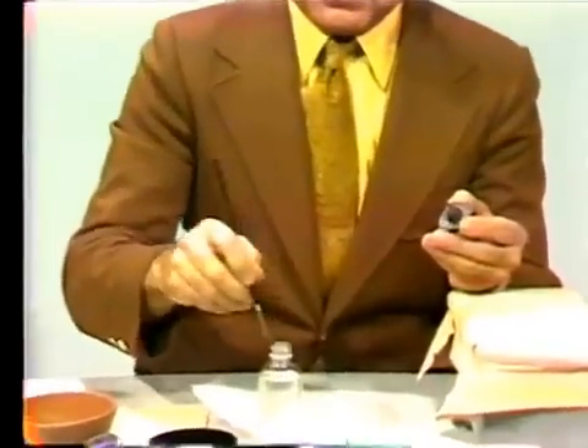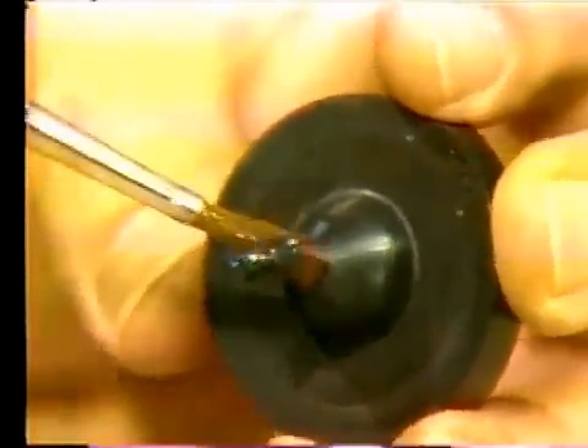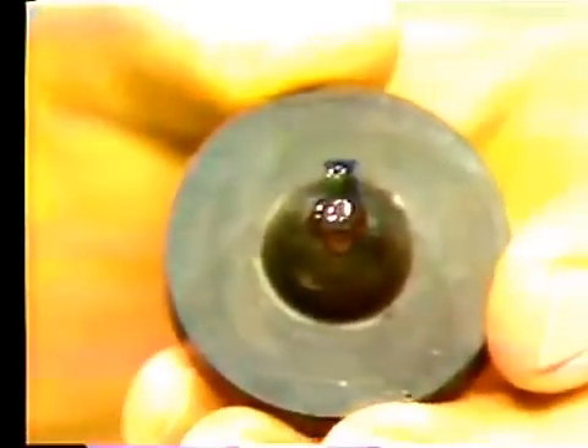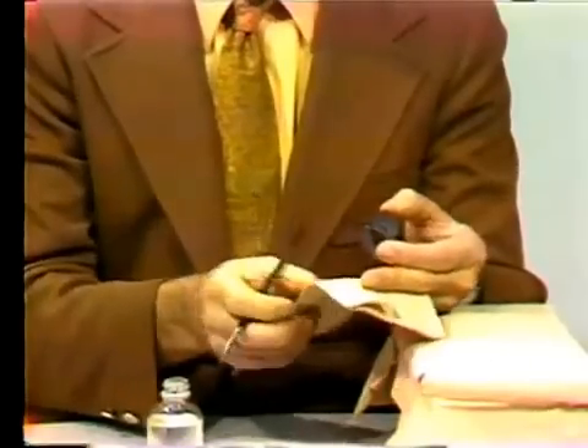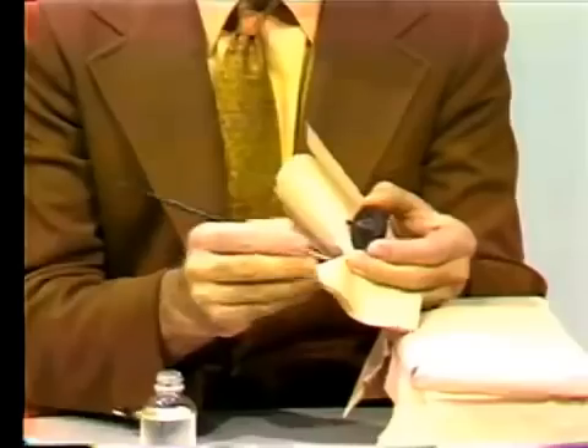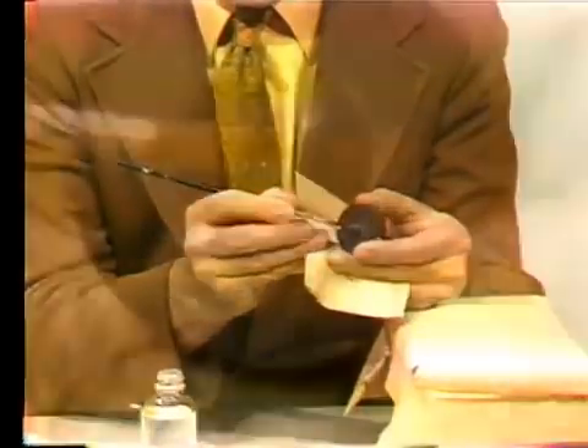Using a regular camel hairbrush, one may put a sufficient amount of debubblizer on the wax pattern. Then one should try to remove all the excess debubblizer from the surface. One way of doing it is to take a paper towel in your hand, dry your brush, and go against the wax pattern, as I am doing here. Each time you go over it, dry the brush.